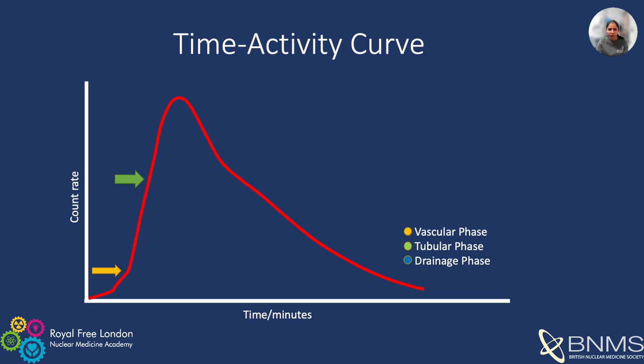Time activity curves are sometimes generated from subregions of the kidney, such as the cortex. It can be approximated by whole kidney transit time or simply by the peak time, which may be delayed in patients with renovascular insufficiency, renal failure, or obstructions.